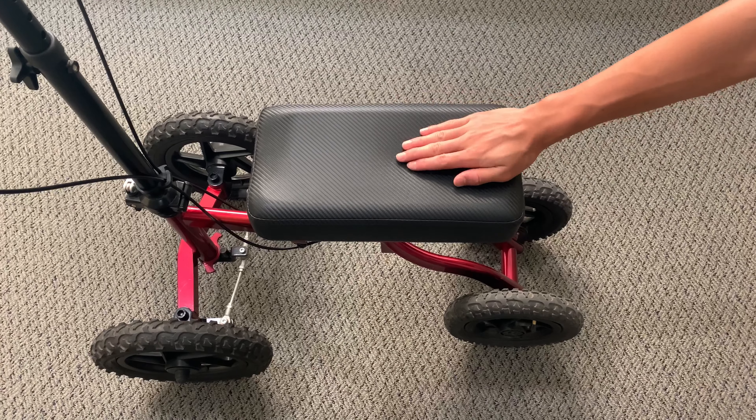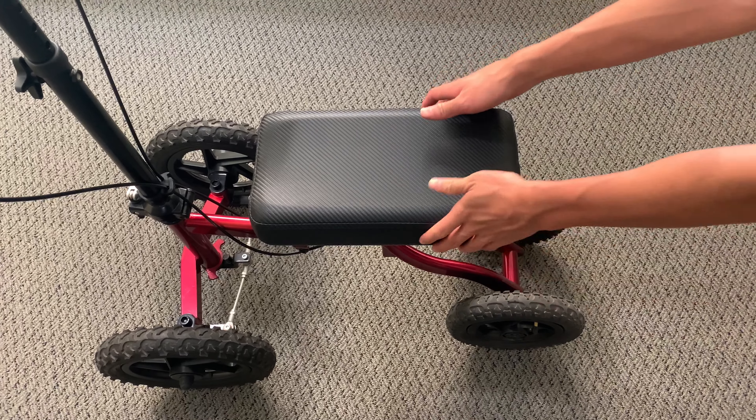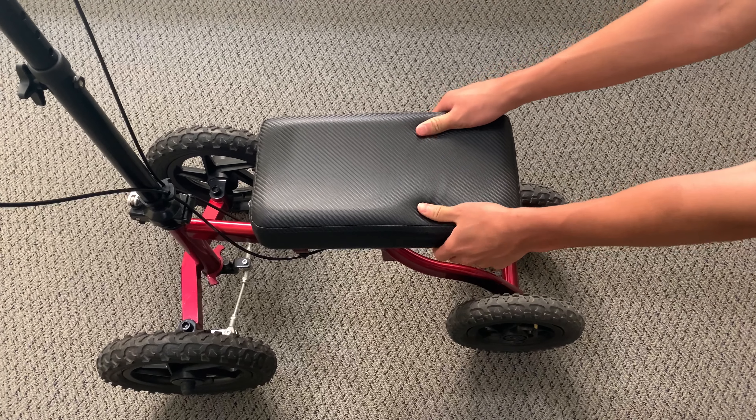The ToughCare All-Terrain Knee Walker is equipped with a padded contoured knee platform for the user's comfort.